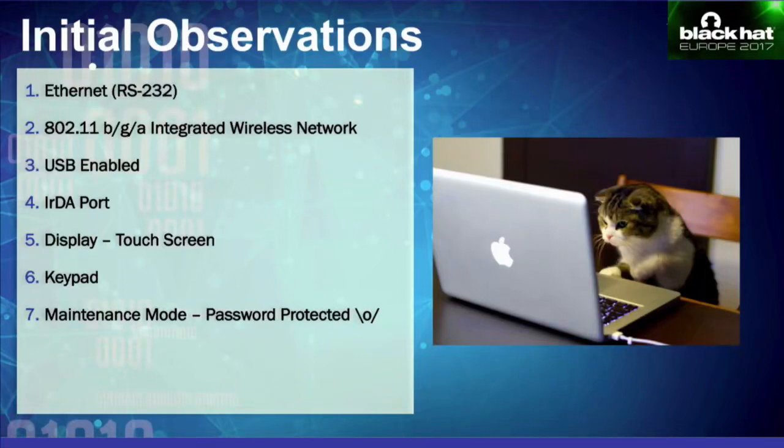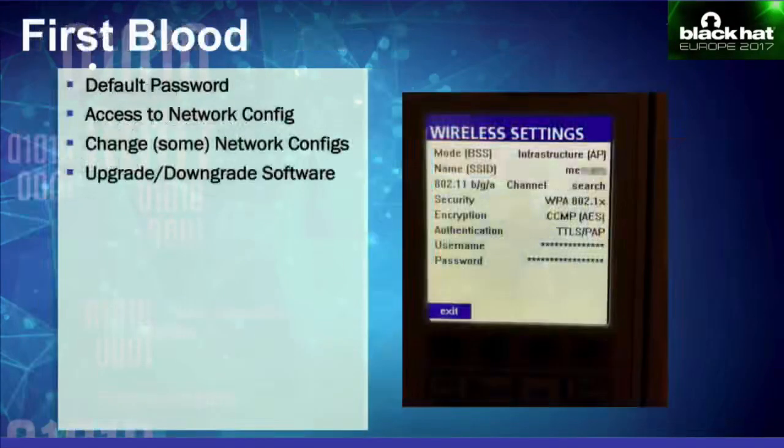It had a touchscreen display, a small keypad, and then we noticed that there was a maintenance mode, but it required a password. So as soon as we saw that there is a maintenance mode, we started to Google if there's a default password which is out there. We tried to locate manuals, help forums, etc. And so we eventually found the default password, and obviously it worked because no one changes the password on these things. It's one of the most common issues. And so when we got the password, we were able to gain access to the maintenance mode.